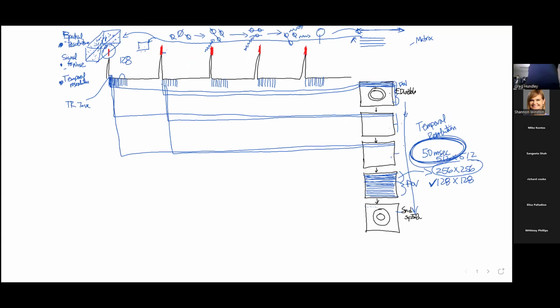When everything is perfectly organized, if you listen to the scanner when it's running, you hear this kind of constant sound. A lot of times it used to be the technologist talking to the patient, but now a lot of that's automated.